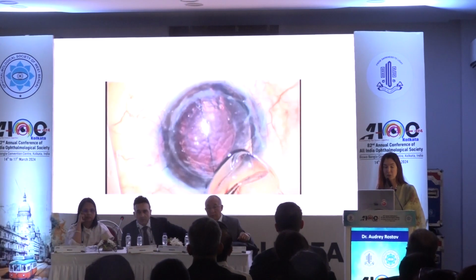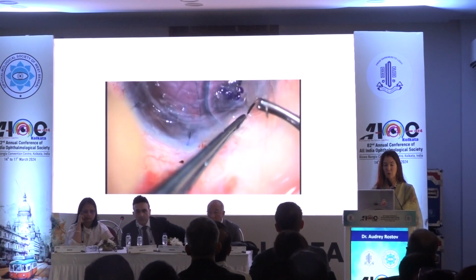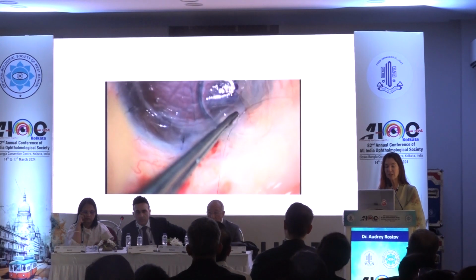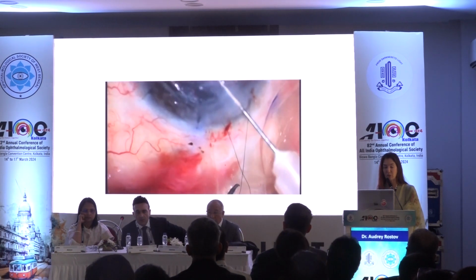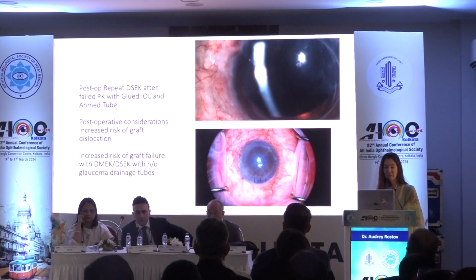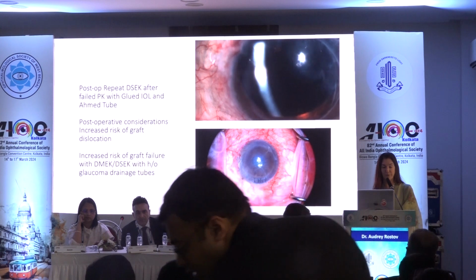They also had a tube. And so it's an older video, but you could see here what I'm about to do is place that suture there so that just in case the DSEK lenticle is going somewhere I don't want it to, and here's a push-in technique. You can also do a pull-through technique. I have that as a safety suture. This is the same patient post-operatively, about a month post-op, and that's the upper photo.